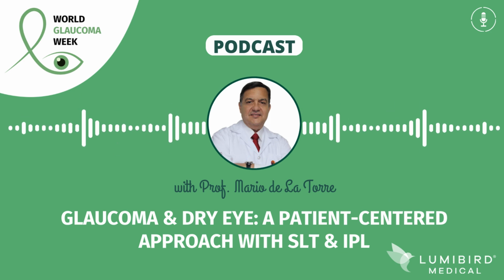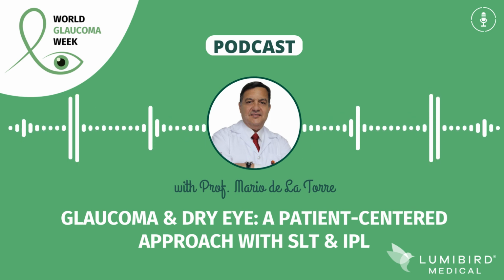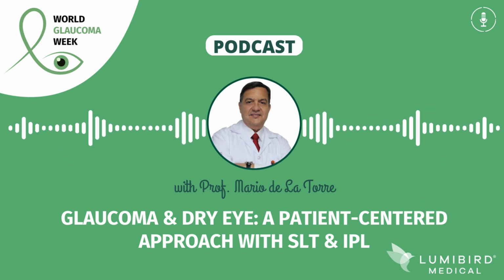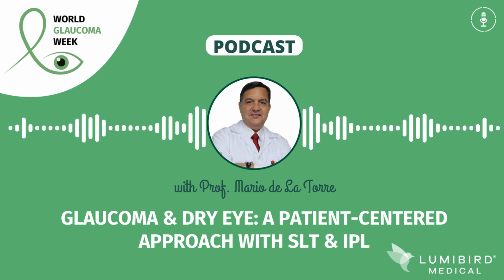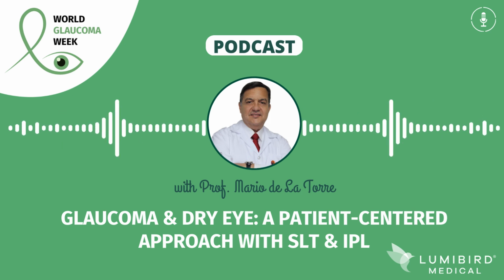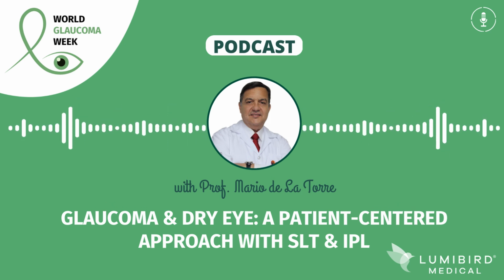So for the follow-up, what were the patient's results in the short term and also in the medium term? Very good. He was very happy with the results. At follow-up visits, his IOP was well controlled. We achieved the target IOP. That means you can plan the target in every single patient. We targeted 15 or 16 in this patient, and we achieved it in time. And we continue to make the evaluation over time. I mean, this is very important.